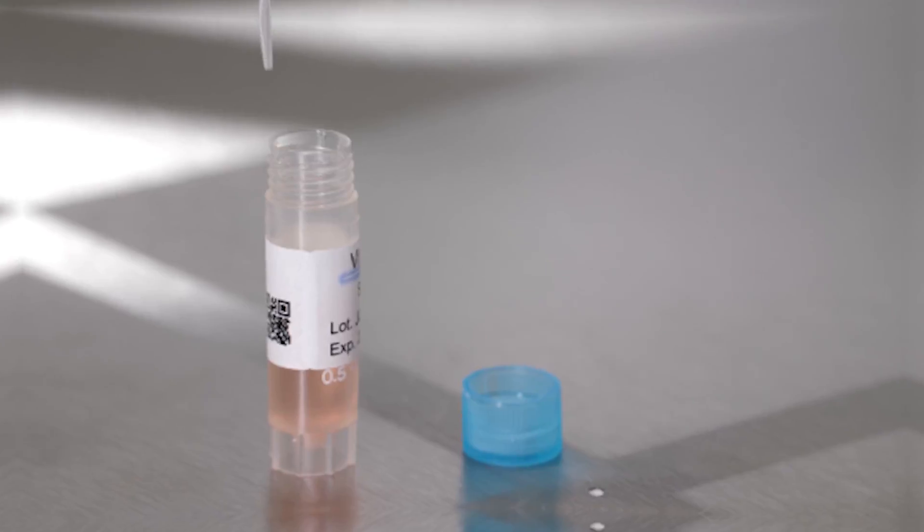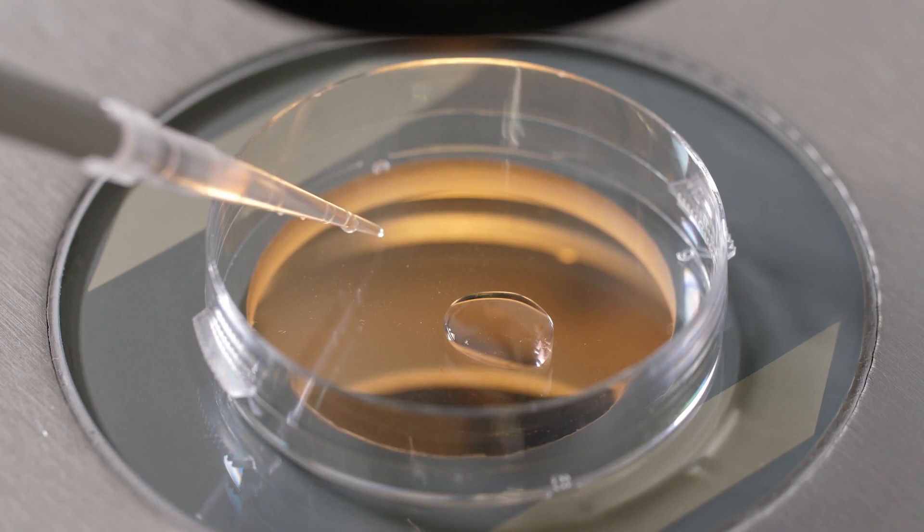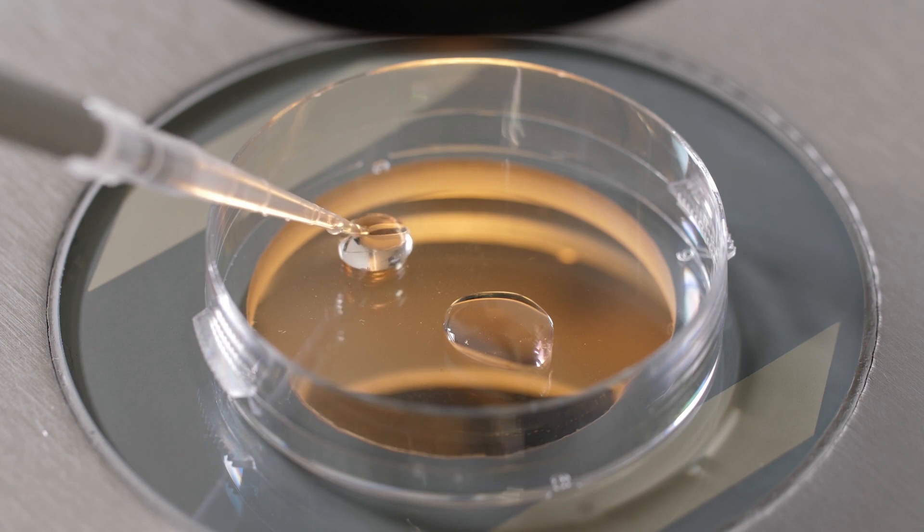Embryos are frozen in specialized media utilizing cryoprotectants, which essentially allows preservation of the embryos in their respective developmental stage, while preventing injury or damage in response to the freezing process.